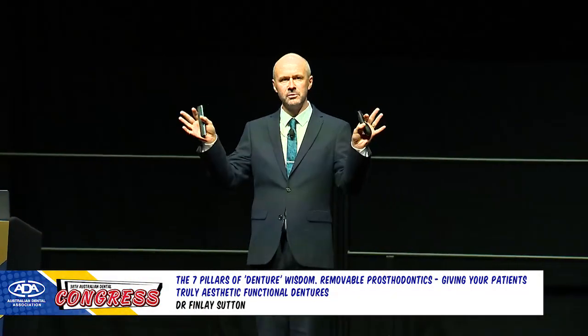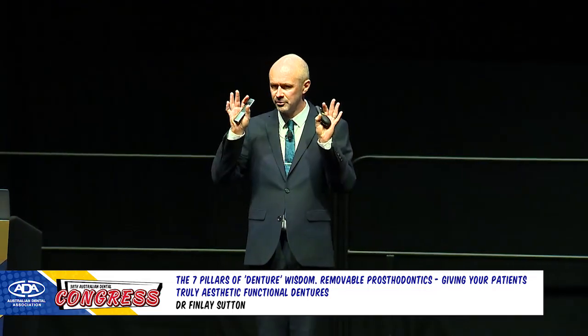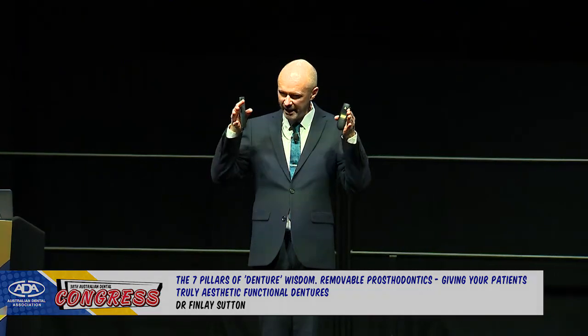I'm going to be talking in general about complete dentures, a little bit on partials, and some implant overdentures in this session.